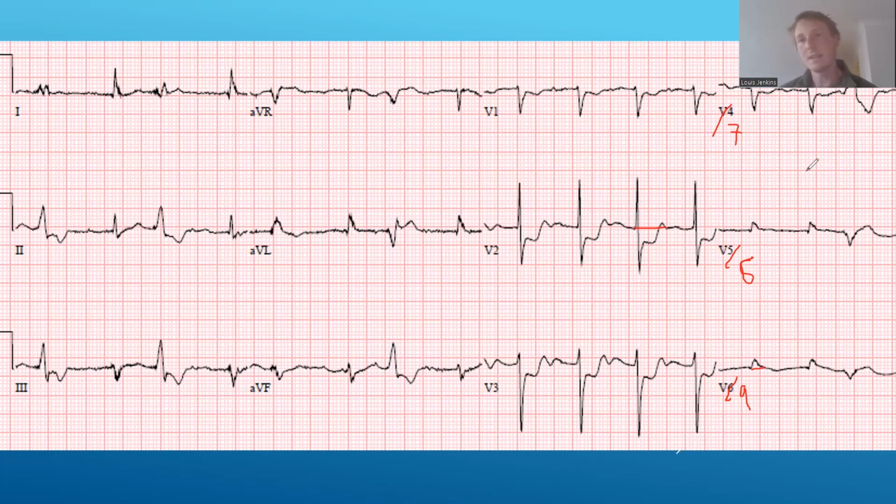But they're going to end up getting an angiogram either way, unless another diagnosis is made in the back of your ambulance, which is entirely possible. Like the previous slide said, only 25% of these patients are having a posterior MI, so there are a lot of other things that can cause this. Anyway, I think there is some ST elevation. I think it is about 0.5 of a millimeter in these posterior leads. So this is a patient that should be going to a cath lab.